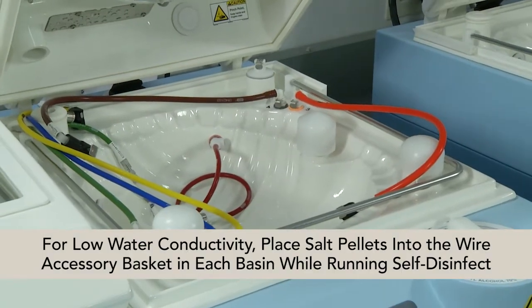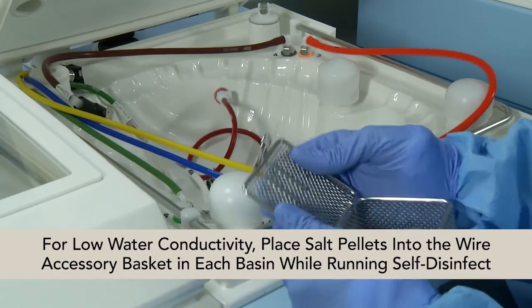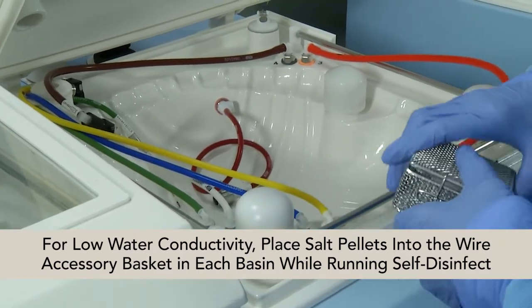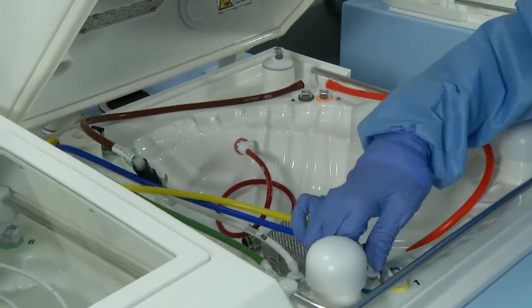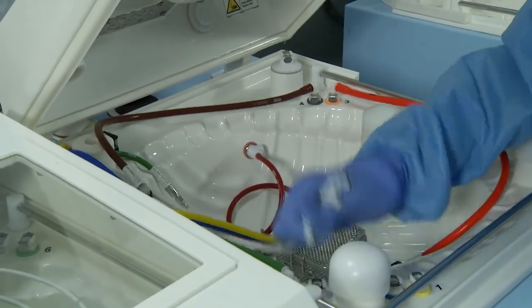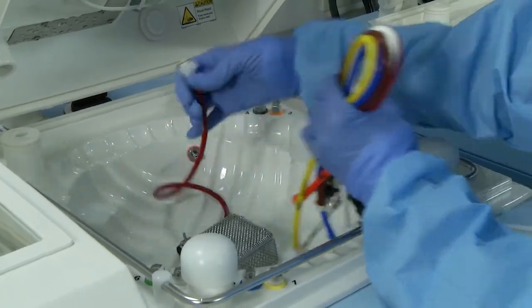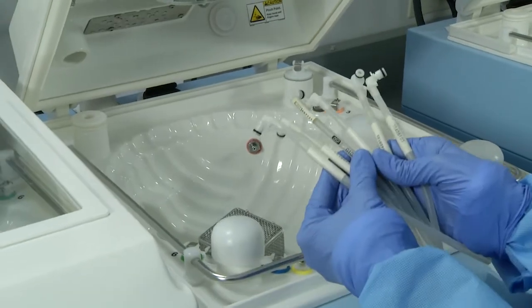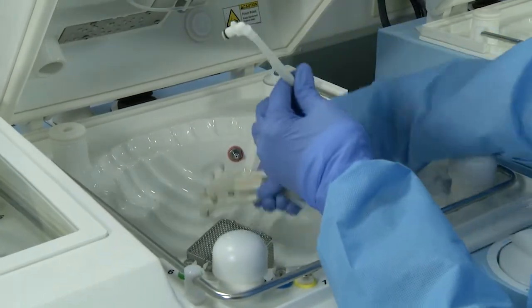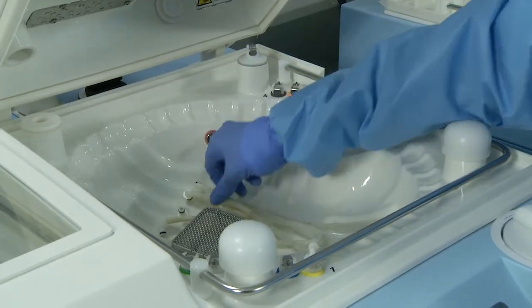If your facility is known to have low water conductivity, you may need to place salt pellets into the wire accessory basket in each basin while running a self-disinfect. To do this, remove all scopes, accessories, and colored connectors. Replace the colored connectors with clear connectors. The red connector should be removed, but not replaced with another connector.